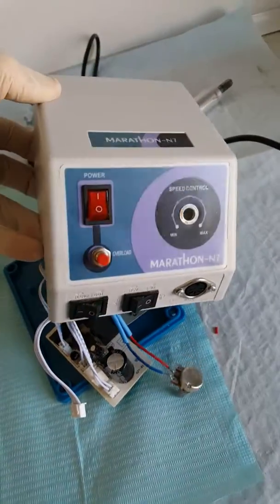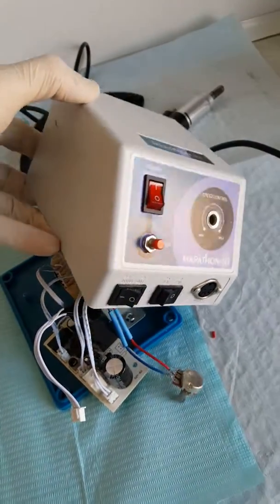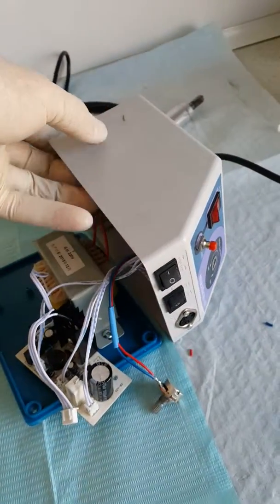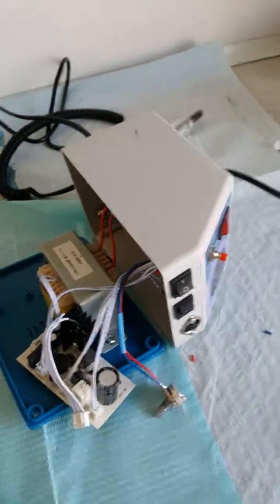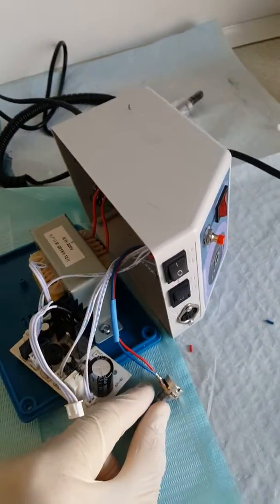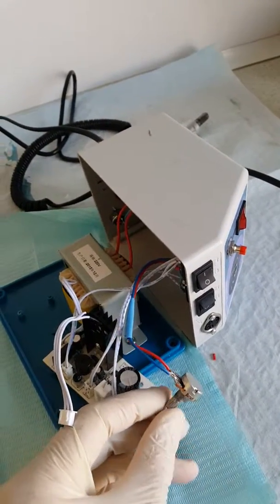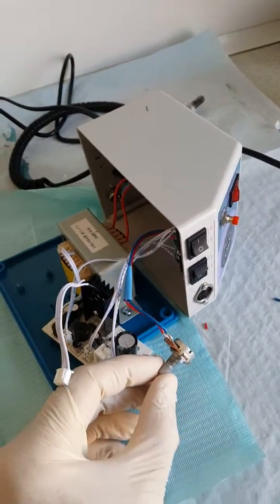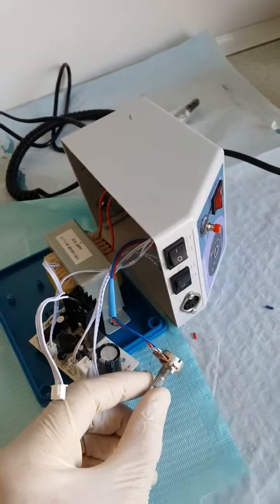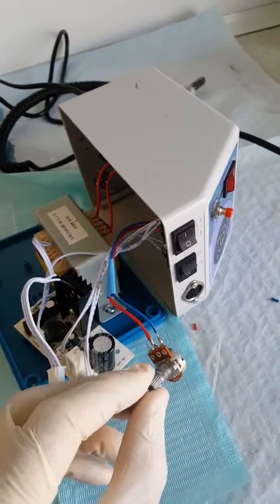I have this Micromotor Marathon N7 and have been using it for a while. It's a good machine. Suddenly one day it started spinning too fast and I could not adjust the speed.